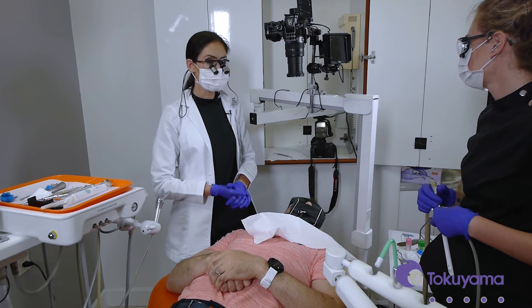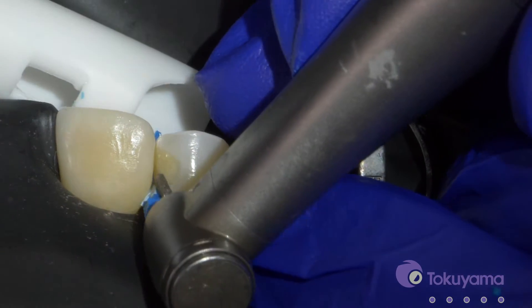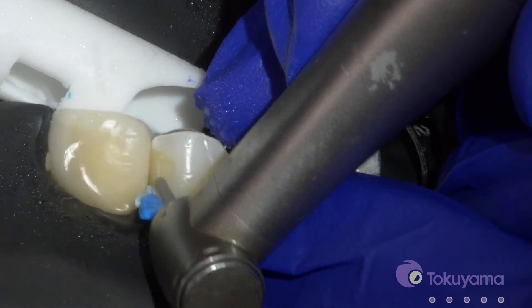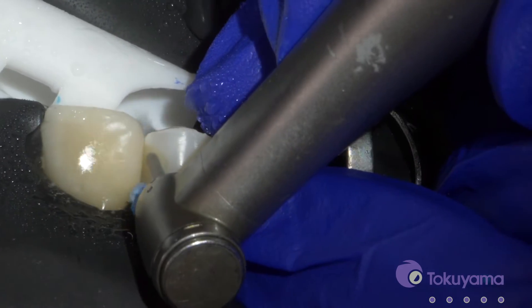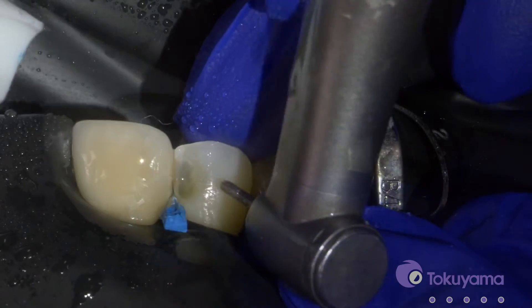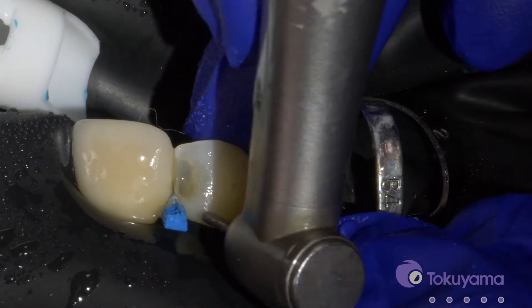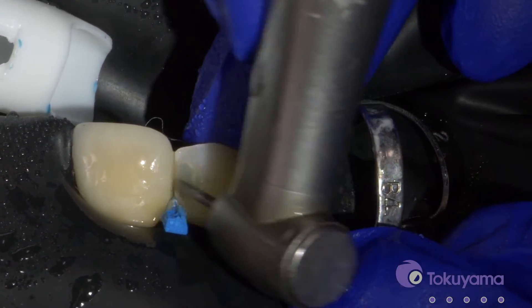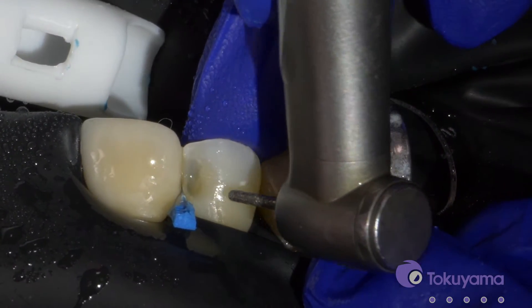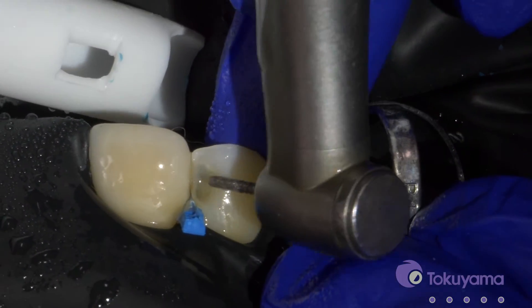Our patient is nice and numb. We've got the rubber dam on, so we'll get going. We've got most of the restoration drilled out, so now we're just going to do a bit of a bevel — you can do more like a starburst bevel as well — just to get different planes of the enamel and better blending with your product.